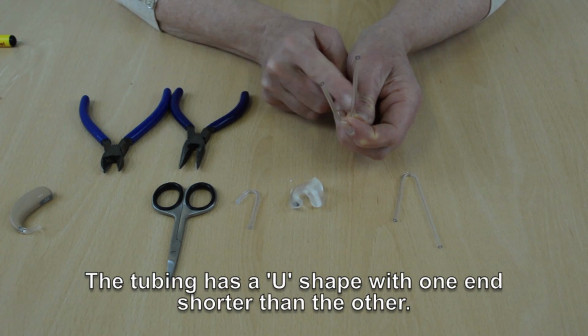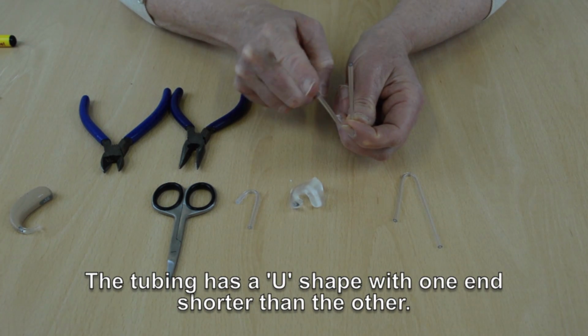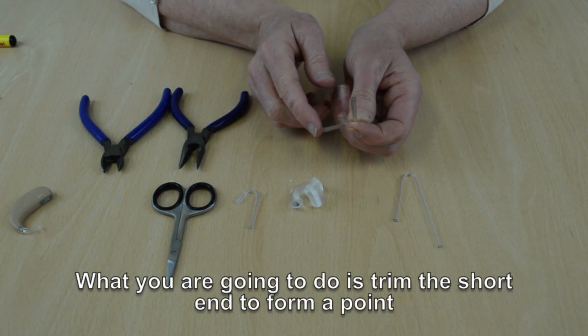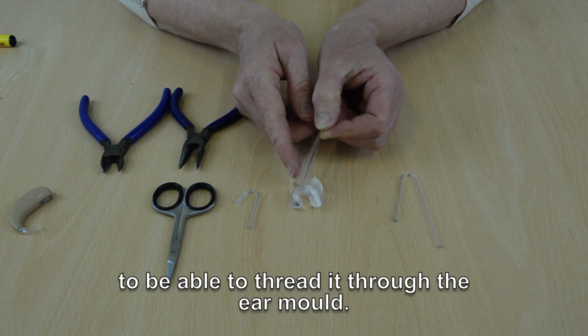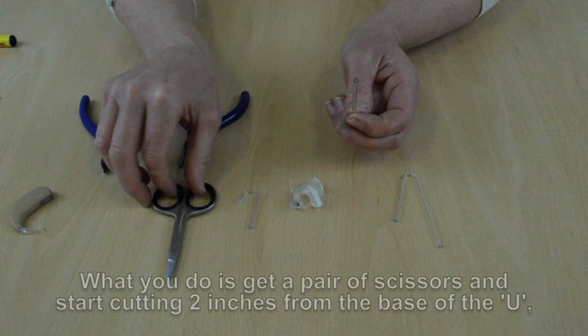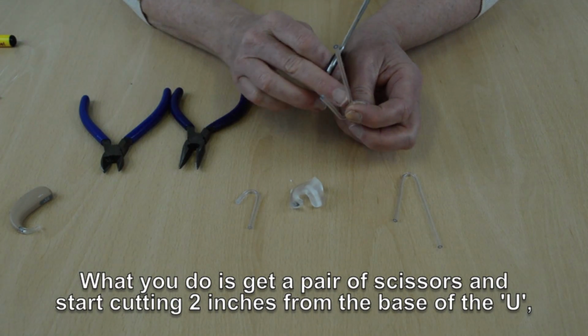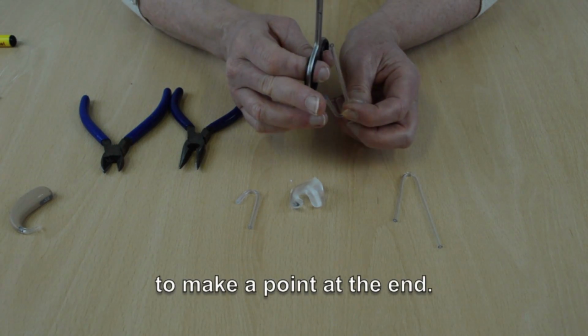The tubing has a U shape with one end shorter than the other end. What you're going to do is trim the short end to form a point to be able to thread it through the ear mould. You get a pair of scissors and start cutting about 2 inches from the base of the U to make a point at the end.